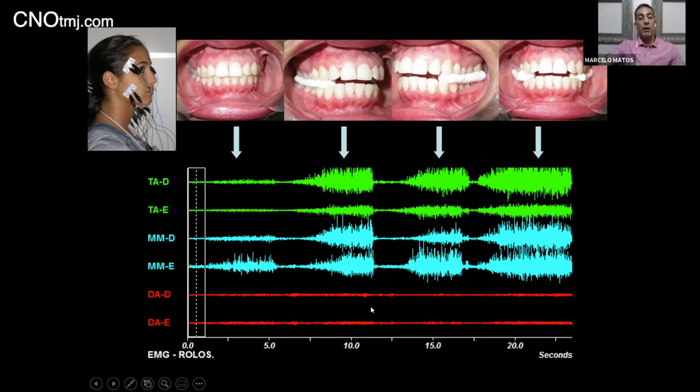So think about this test. Now you can see why the person during clench is not properly working. A masseter, a muscle, for example, that we learn from dental school was one of the most powerful muscles of the body, but this person here is clenching hard and the masseter can barely fire. So think about that. I'm going to show something combined.